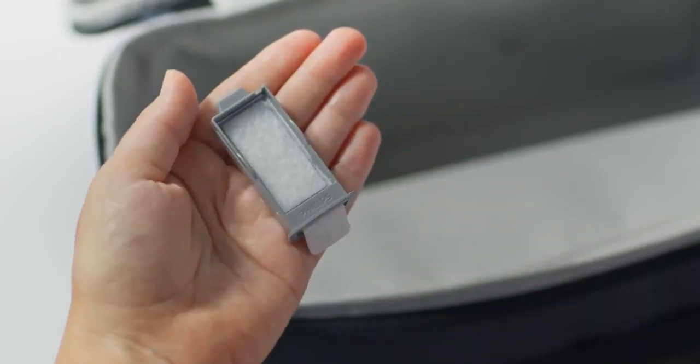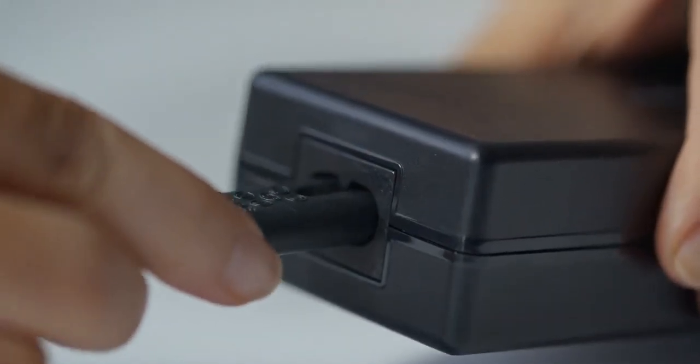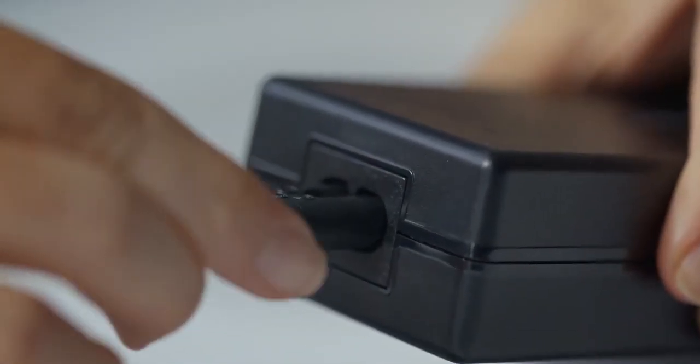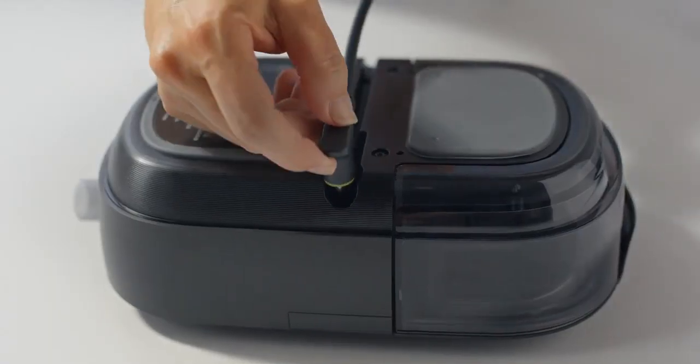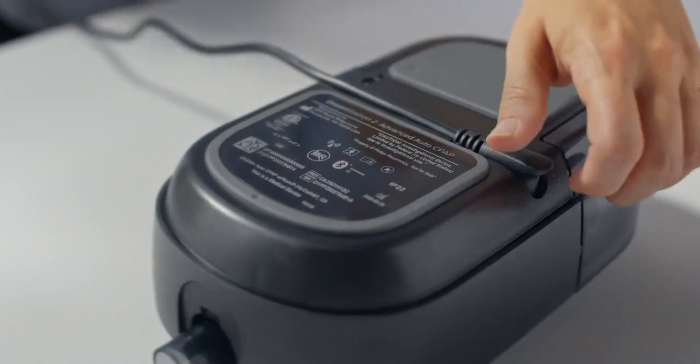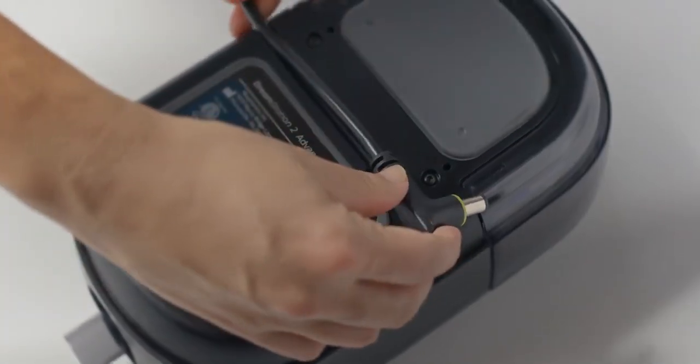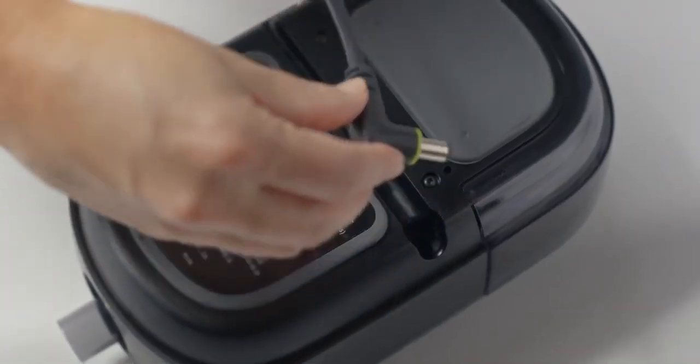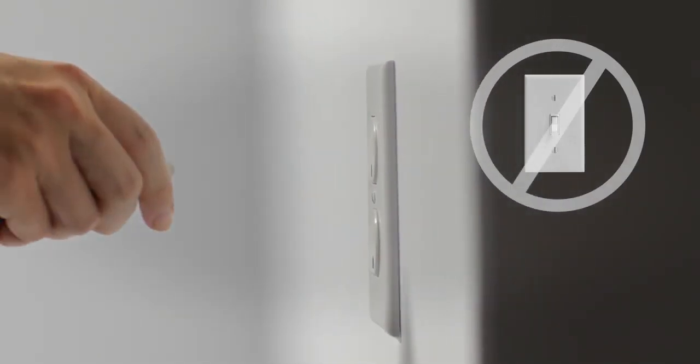Attach the cord to the power supply and plug the connector into the power inlet on your device. Notice that the cord can be routed in either direction. Plug the device into an electrical outlet that is not controlled by a light switch.